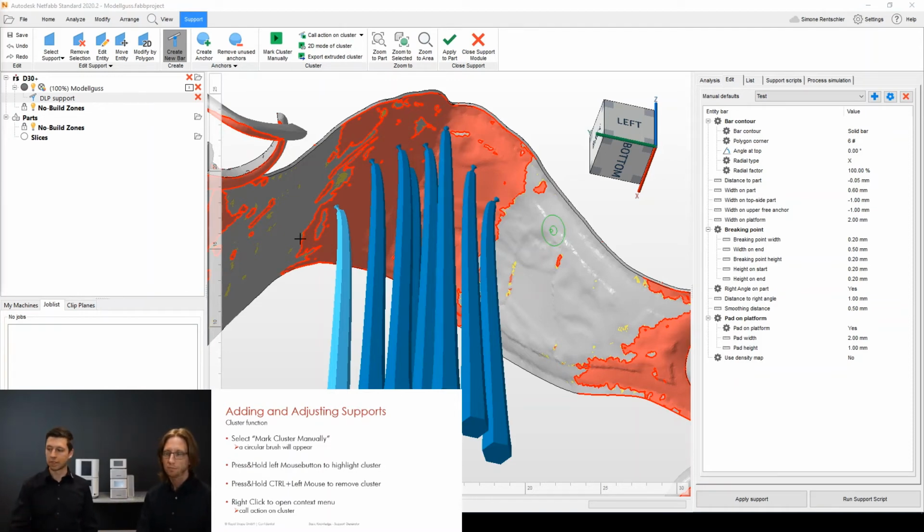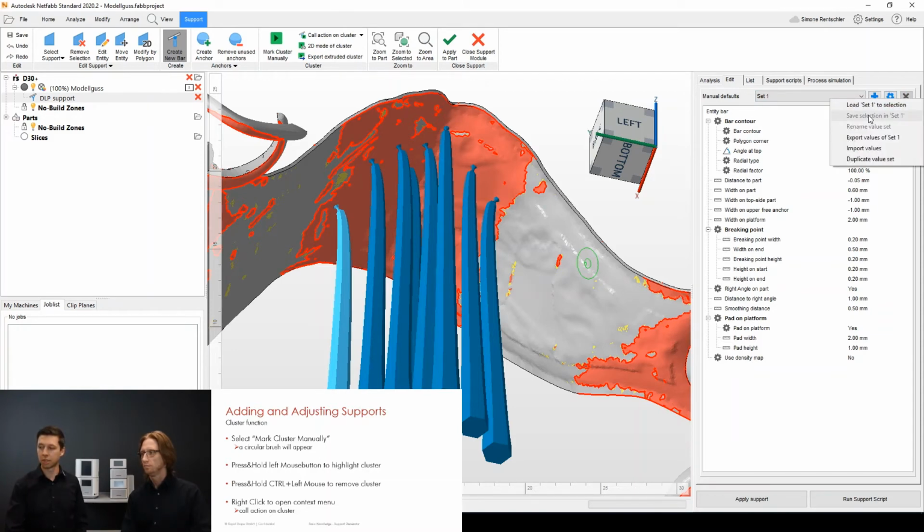Maybe also for the last topic, maybe you're asking yourself, why do I have to create a new set? So Robert mentioned there's always the predefined set, the set 1, and if you just click on the settings button, you can see we cannot save anything in this set. This means you try to save it, but you can't, so you also can't write some information from this set to another one, because this will always be the default one. That's the reason why we have to create a new one, just for your information, in case you were wondering already. So, but let's go back to the next slide.